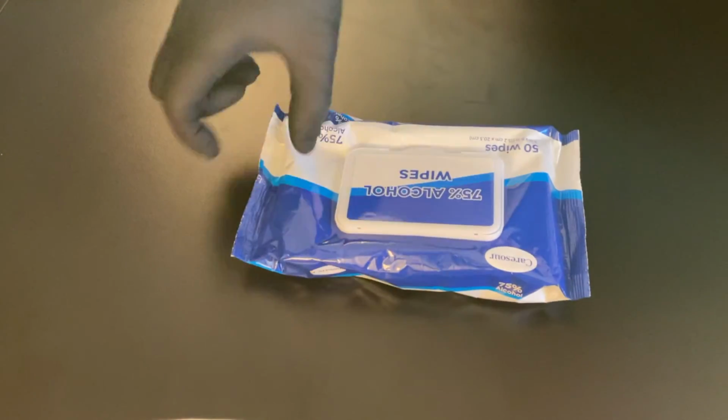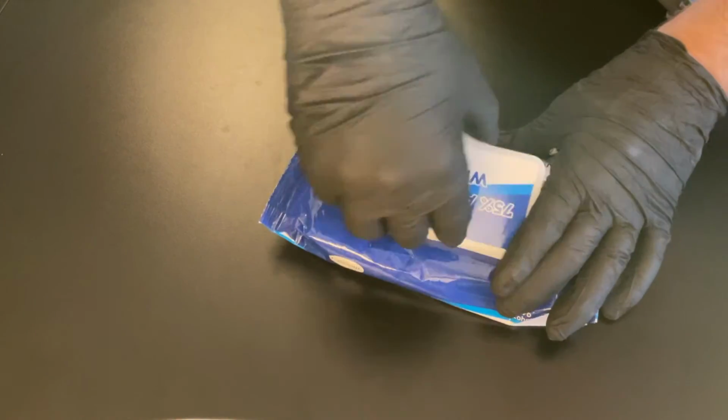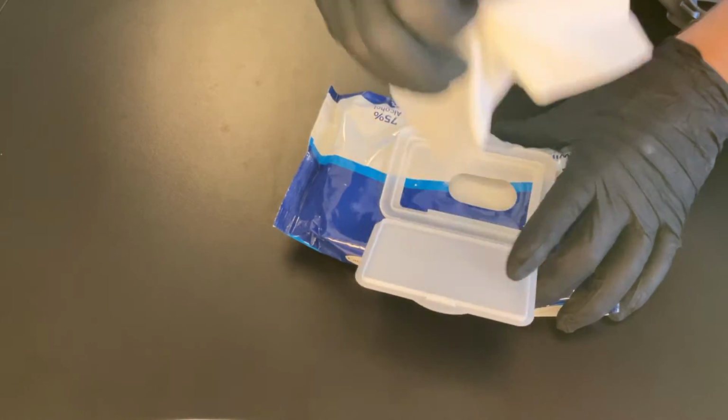To assemble your Breathe3D mask, start by cleaning the mask. Wipe down the mask with an alcohol wipe, or, if possible, a medical-grade disinfectant wipe.